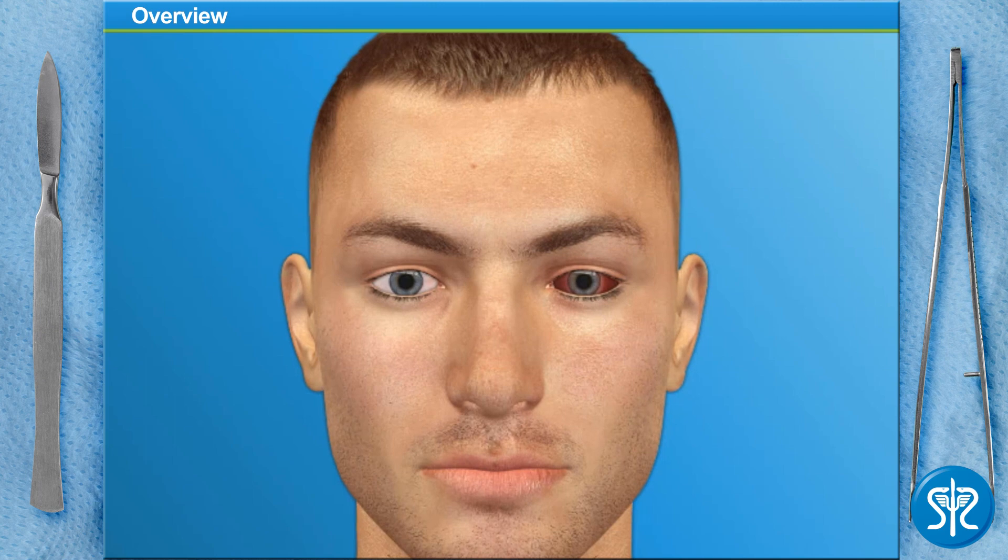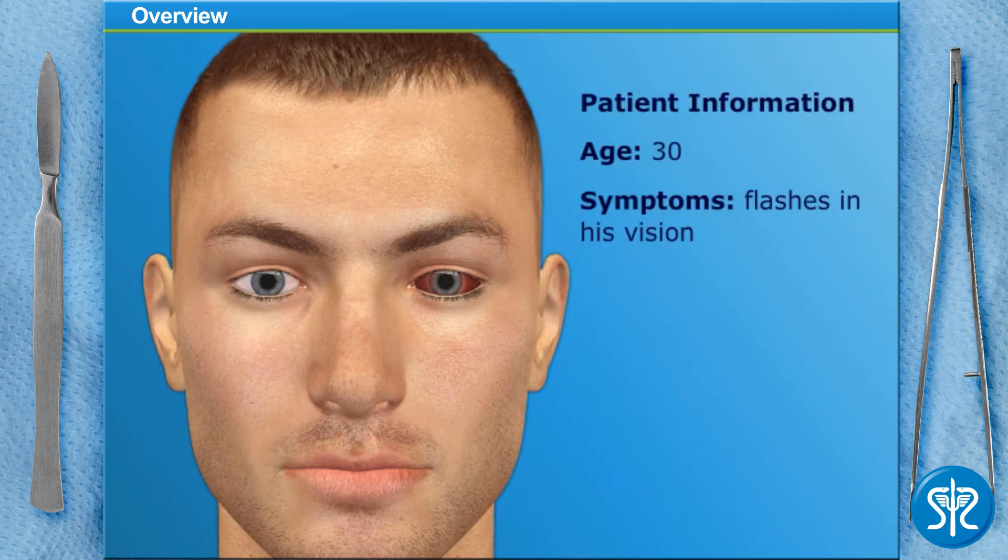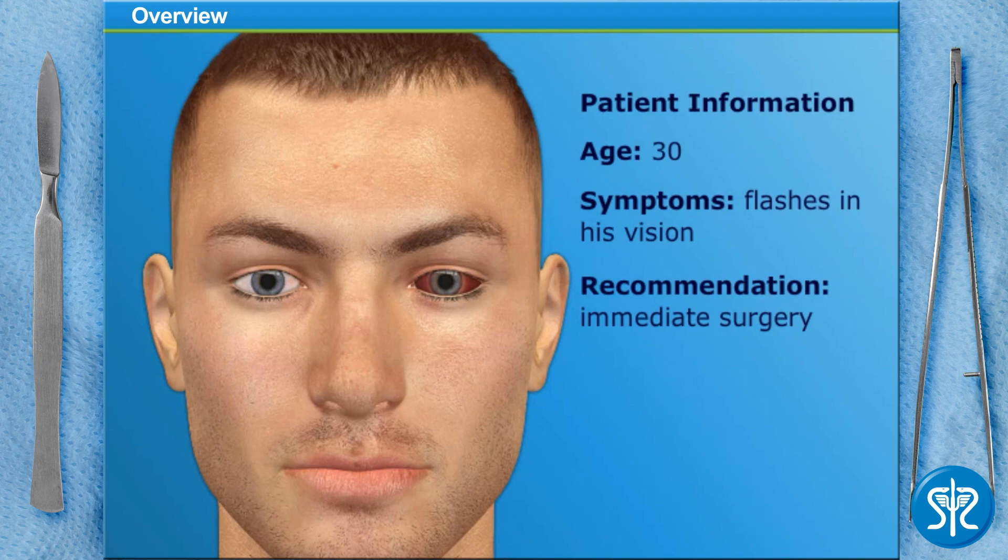Our patient today is a 30-year-old man who recently noticed flashes in his vision. His ophthalmologist dilated the eye and detected a retinal tear and a detachment. He recommended immediate surgery to limit additional loss of vision. Let's begin.